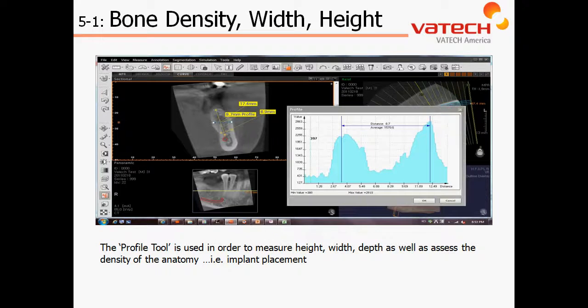At this point, it's encouraged to stop this video and then navigate to the EZ3D software to perform the steps: measurements using the 2D ruler as well as assessing the bone quality utilizing the profile tool.